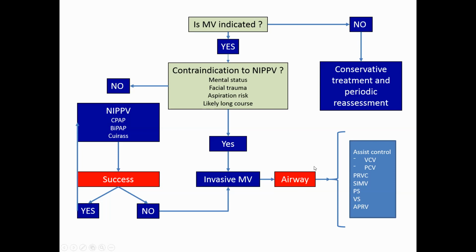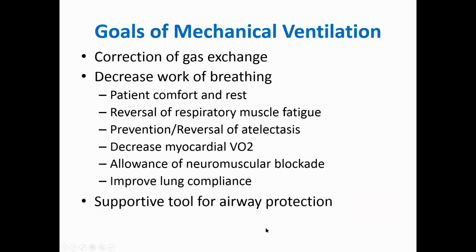The minute you go into mechanical ventilation, you establish an airway, and then you can go into whatever mode you want. The most common, and for this part of the talk we're going to focus on, are assist control, SIMV, and pressure support. The other modalities we'll talk about next time. The goals are correct gas exchange, but more important is to decrease the work of breathing.